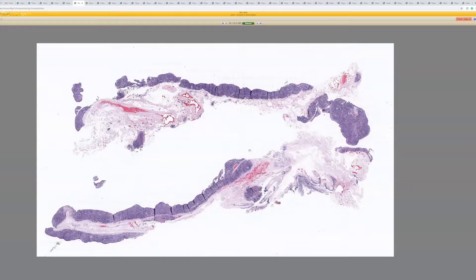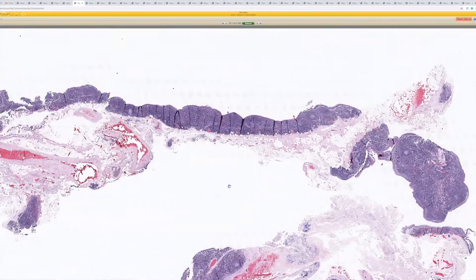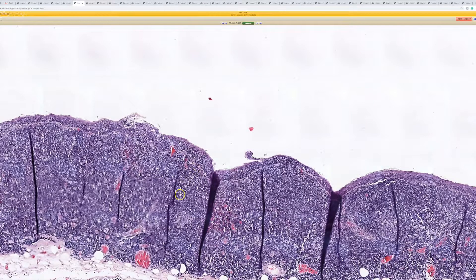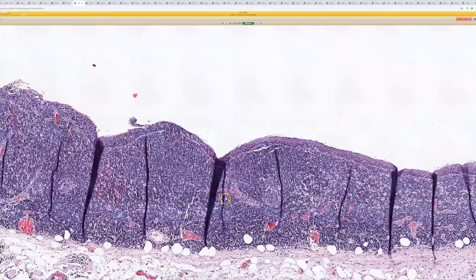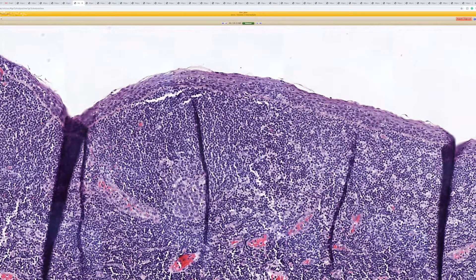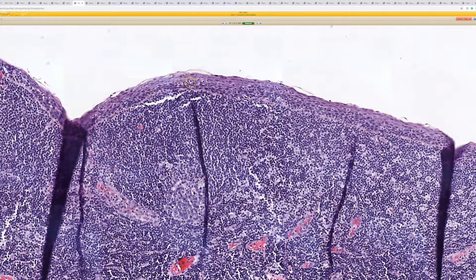The first thing that stands out is the blue infiltrate, which is probably a big collection of lymphocytes. You can see towards the top, it actually has a little squamous epithelial lining, so it probably represents a true cyst.